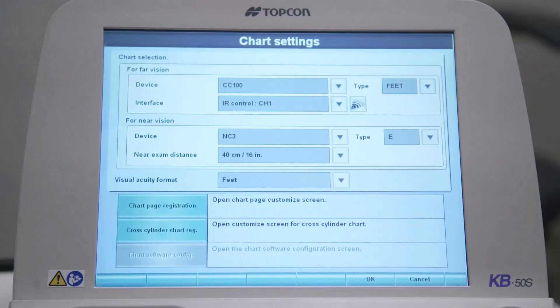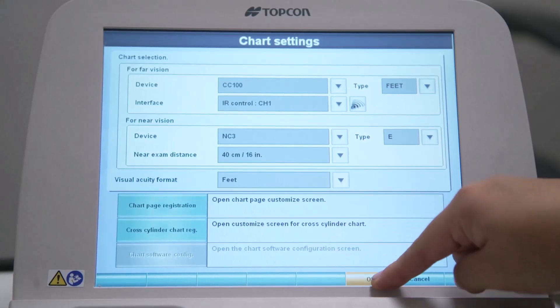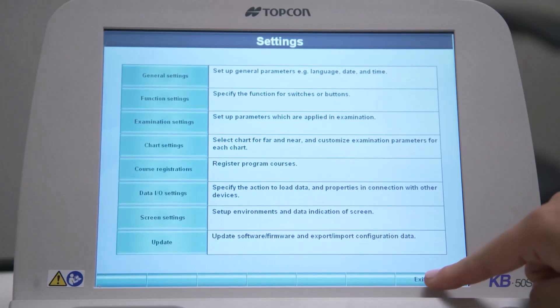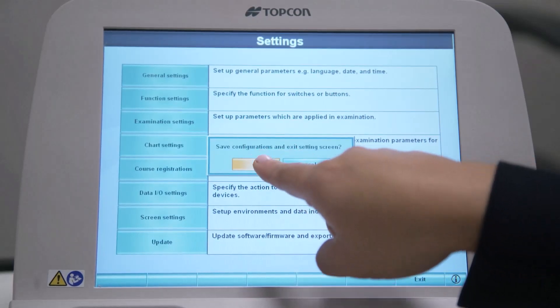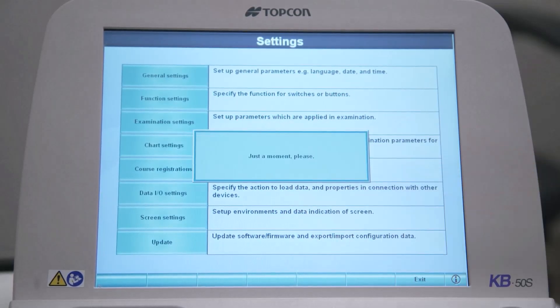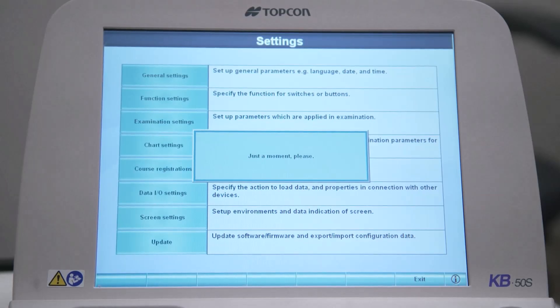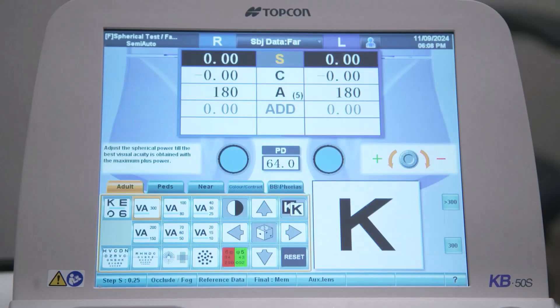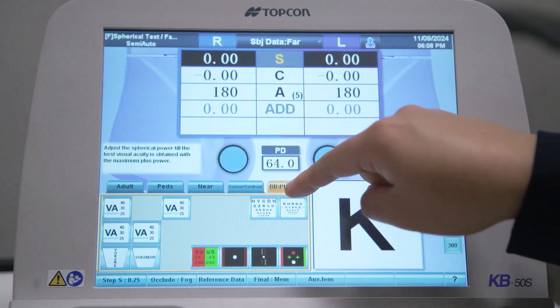After you've made all the changes you want to your tabs and chart icons, select OK to return to the settings screen. Select the Exit button and two options will appear. Select OK to save the changes you've made, or select Cancel to stay in the settings. Once you select OK, the CV5000 will reset. Once the reset is complete, you will be able to use your customized tabs and charts during patient refractions.